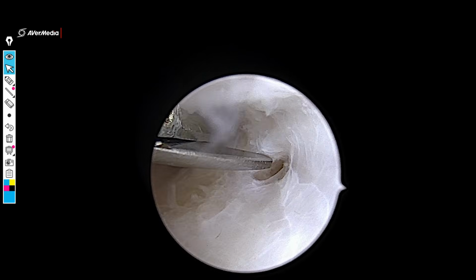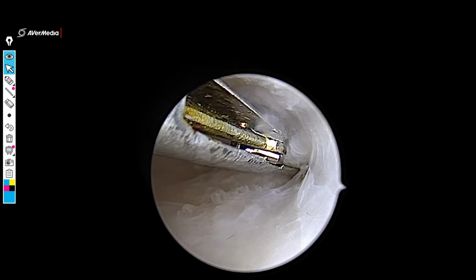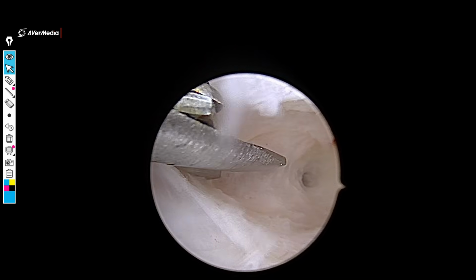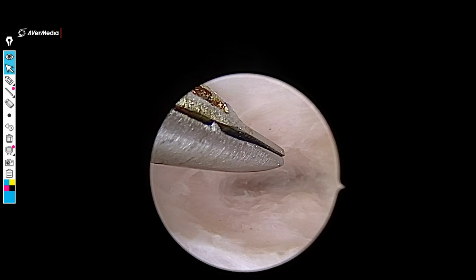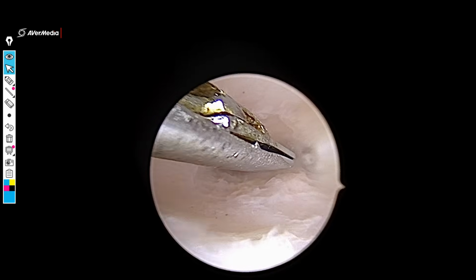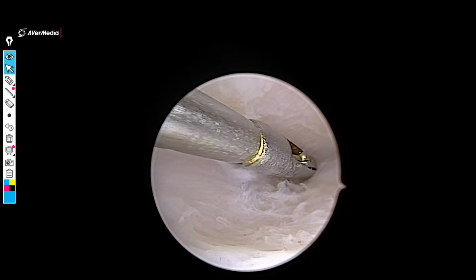Once the ostium is found, and notice that every time it may not be possible to find the ostium as well. So it is lucky that we've been able to get the ostium on one side, but the question is whether it really is the ostium. So I gently divide the synechia around it, and you can see that ostium has gone away. That was not the ostium, and that is definitely not the fundus. We still have more synechia. So the scissor is poked, and you can see how the scissor is going inside.